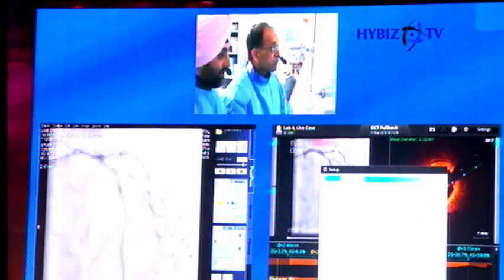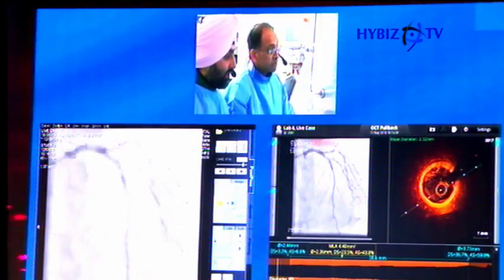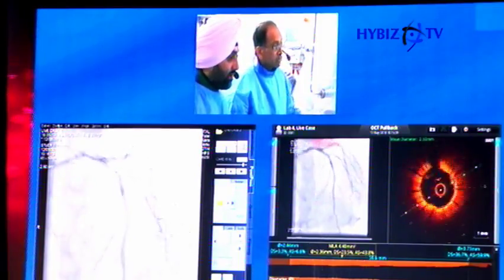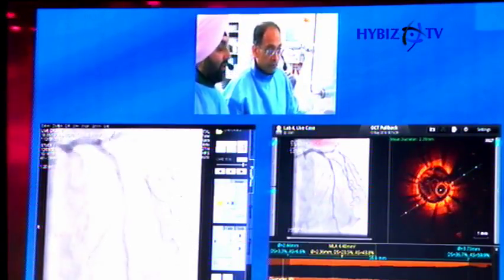But almost certainly we need postdilatation both at the mid LAD, at the second septal, and at the proximal septal. The diagonal branch wire is left in at the moment. We'll consider removing that at one point, I suspect fairly soon. We'll just see what the ostium looks like on this view.